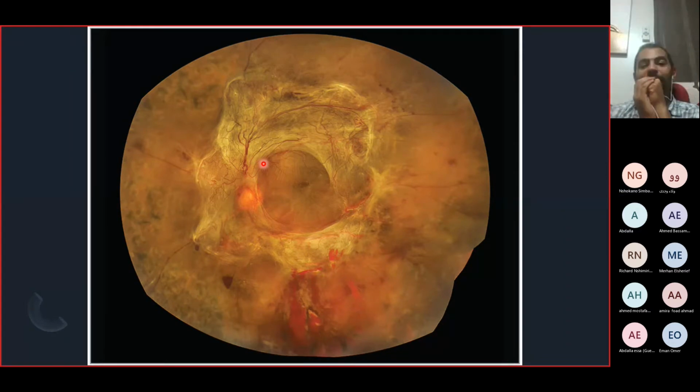Okay, delamination. There is another technique called segmentation. In segmentation, you use vertical scissors, and if there is adhesion between this point and that point, and the adhesion of the membrane to the retina is very thick, so you cannot separate the membrane from the retina, you cut the membrane here so that this point will relax and not be pulled towards that point. It's usually done with vertical scissors rather than horizontal scissors.